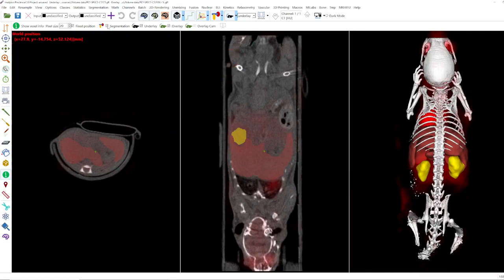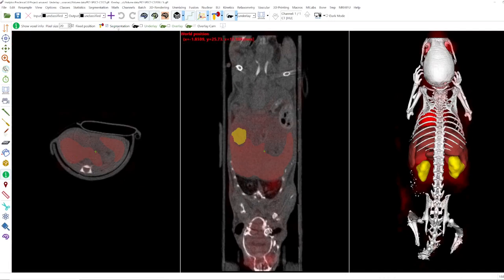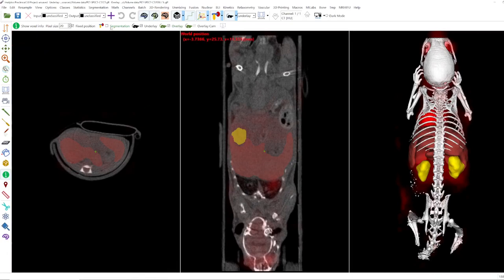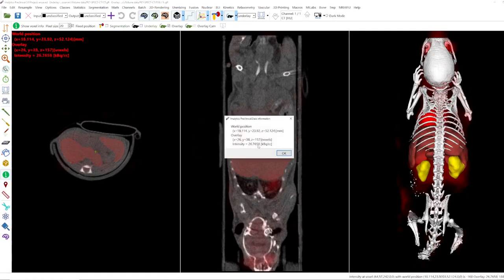You can also activate and deactivate the information you want to see. For example, if you want to see only the segmentation information like the class name, or only the information for the underlay — such as the voxel coordinates and intensity — or if you want to see all three, you can activate and deactivate whatever you need. This information will also appear in the box.